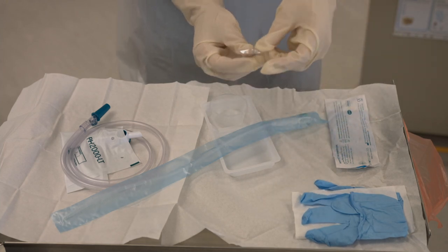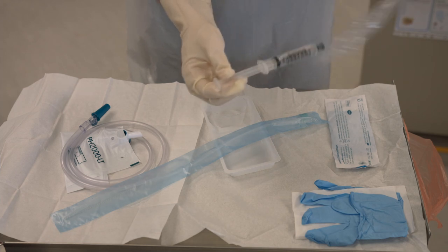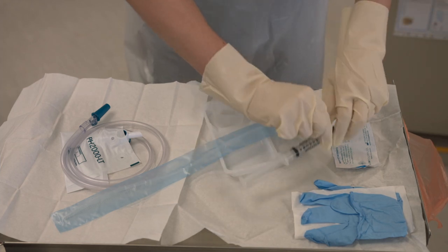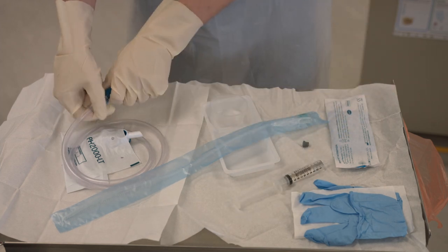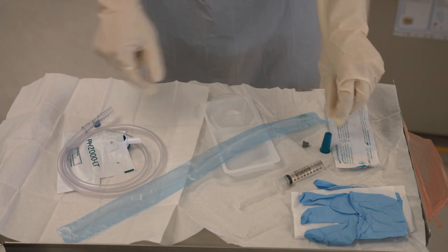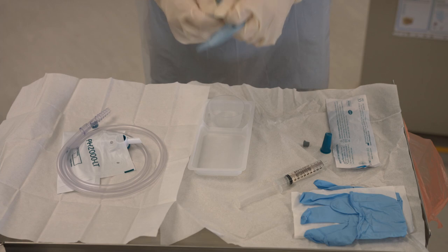First, open the package and take the cap off the water for inflation of the balloon. Next, take the cap off the catheter bag. Then open the back end of the perforated bag for the catheter.